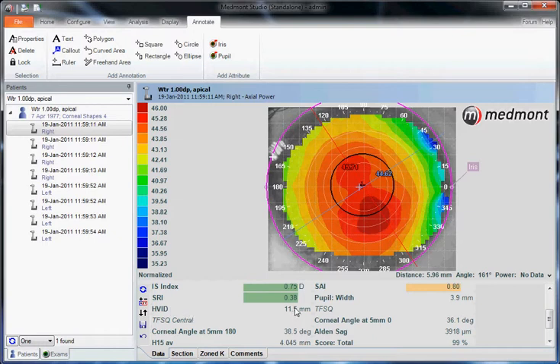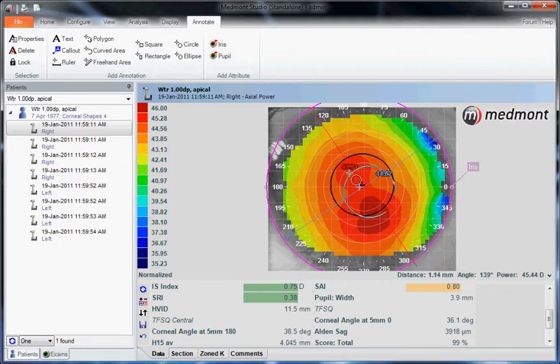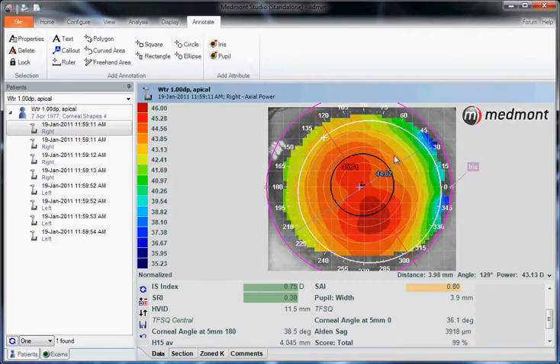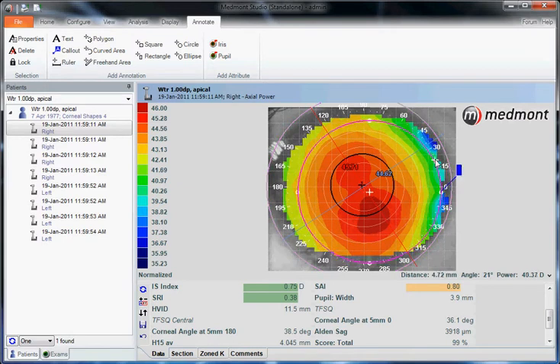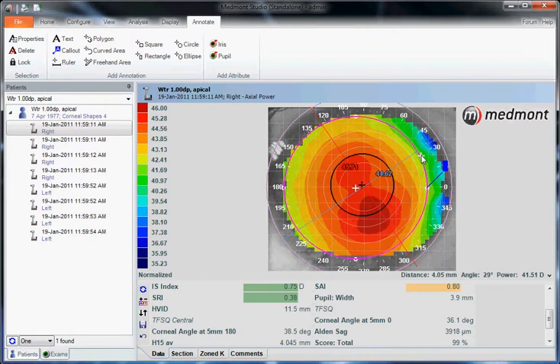So this annotation tab allows us to add anything to the window that we would prefer to show or highlight a particular area of the topography.